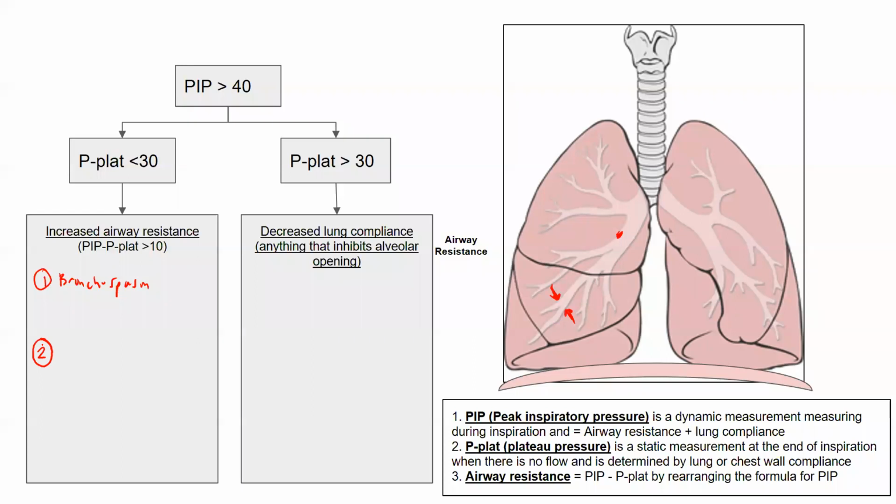Tube kinking. Yeah, remember this airway goes all the way up to the ET tube as well. So if someone has a kinked ET tube, here it is kinked, it's not very good, but I try my best, that's also going to narrow your airway, and that narrowing is going to increase your airway resistance. Perfect. That's one thing to absolutely think about. And all these things you're going to call respiratory for. Vents are complicated. There's one more that can do it.